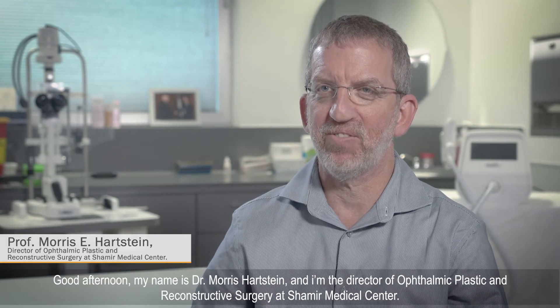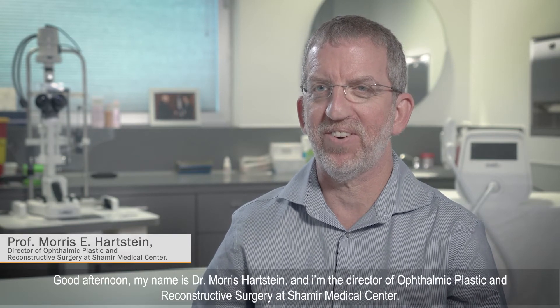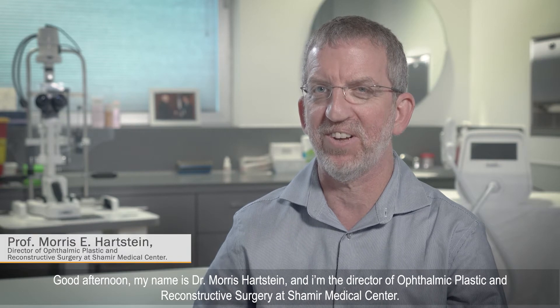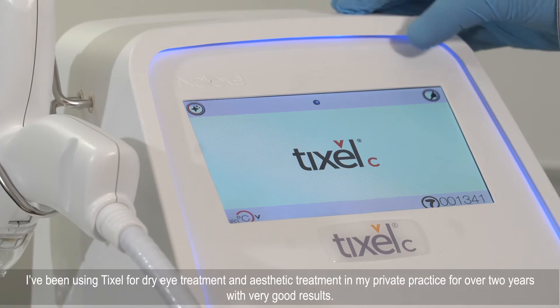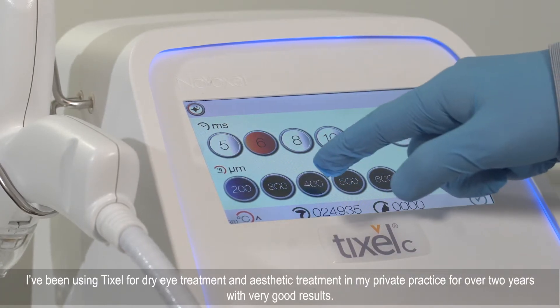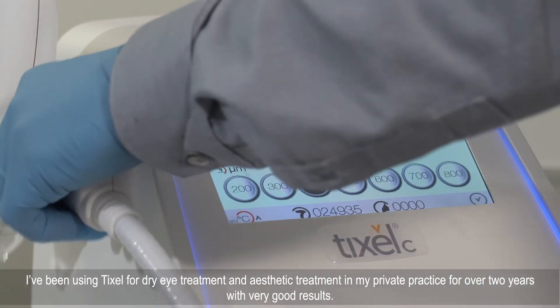Good afternoon, my name is Dr. Morris Hartstein and I'm the Director of Ophthalmic Plastic and Reconstructive Surgery at Shamir Medical Center. I've been using Tixel for dry eye treatment and aesthetic treatment in my private practice for over two years with very good results.